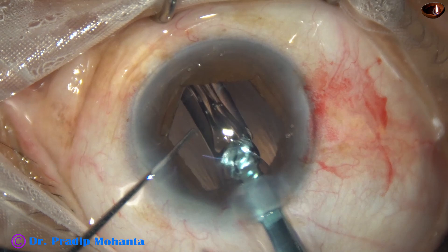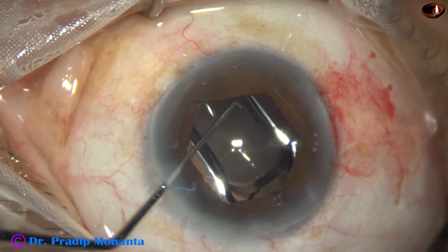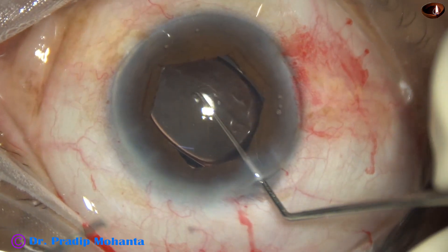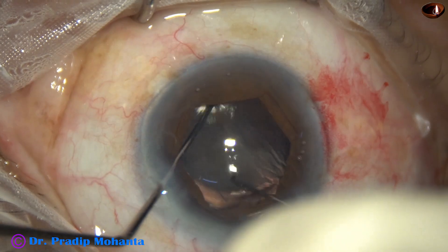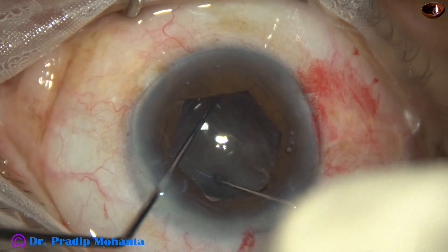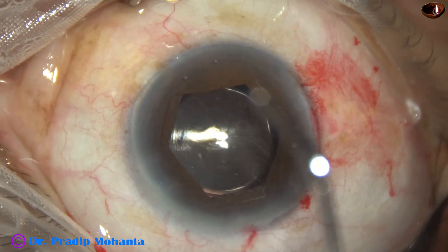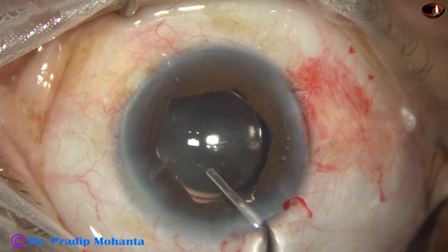Recently it happened that the trailing haptic pressed the flange and both the flange and the trailing haptic went into the back, making it very difficult to remove the B-Hex without cutting it. So to be on the safer side, without much manipulation, we should cut the B-Hex and gradually pull it out.